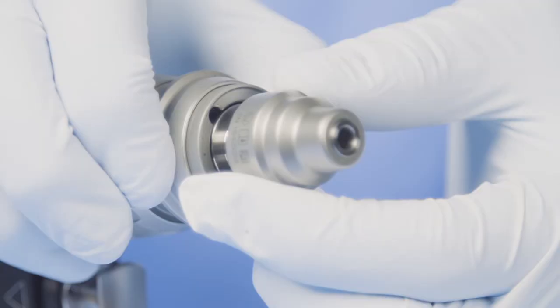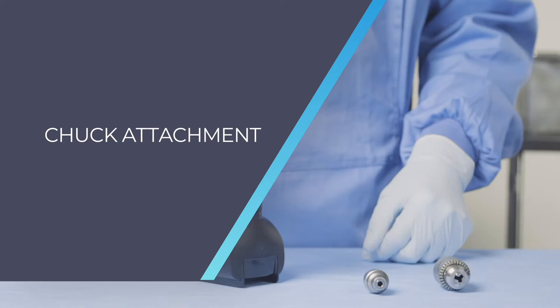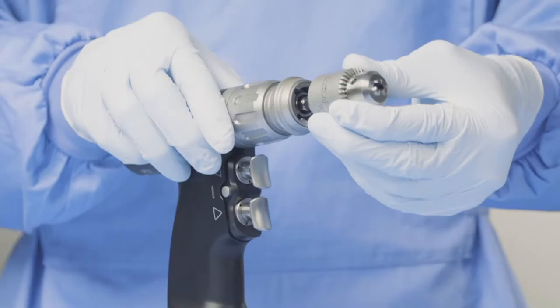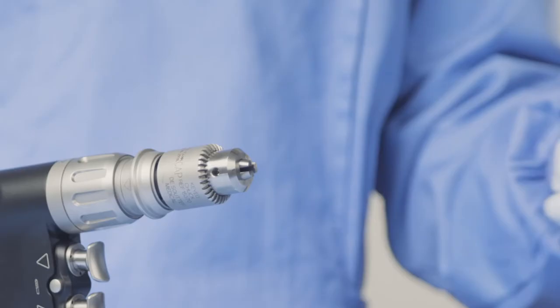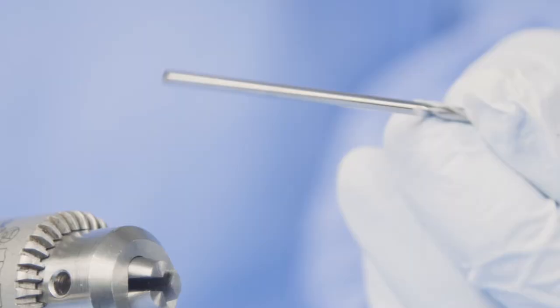If we now take a look at your Jacob's chuck attachment, place it into the tool, and then this time, get a straight shank drill bit. This type of drill bit has no notches and is just a perfect cylinder.